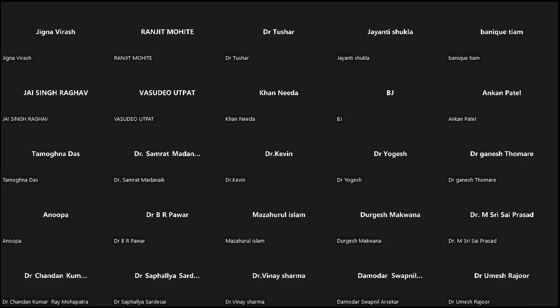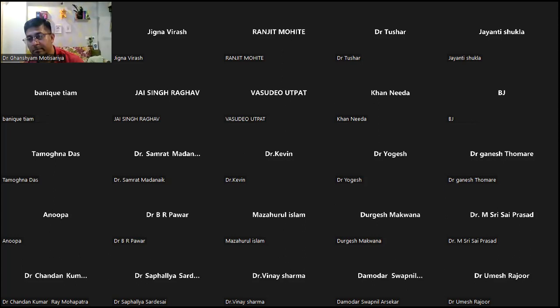Sir, what about TR, sir? Tricuspid regurgitation, we have taught about it, but we'll be teaching it again. Tricuspid regurgitation is the same thing. We look at a four-chamber view or a modified four-chamber view or focused RV inflow view. We look at the vena contracta in the tricuspid four-chamber view itself, the amount of blood which is flowing through the tricuspid valve. That is vena contracta.